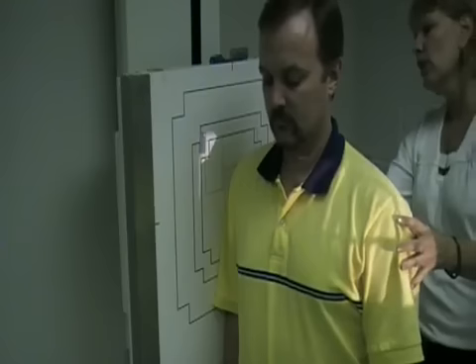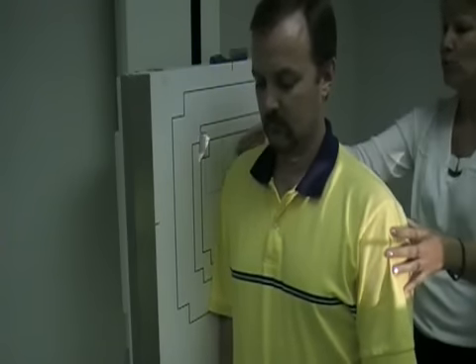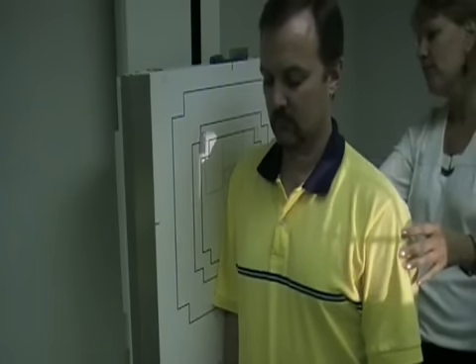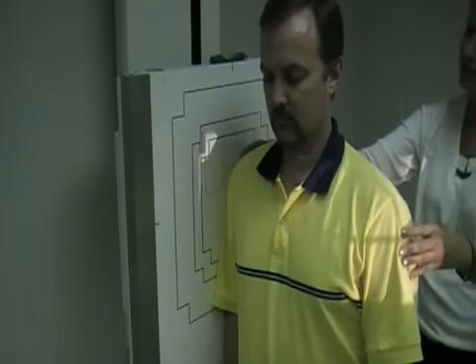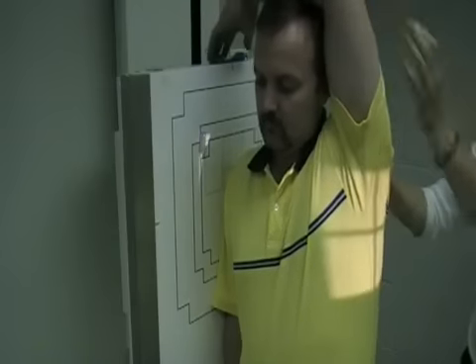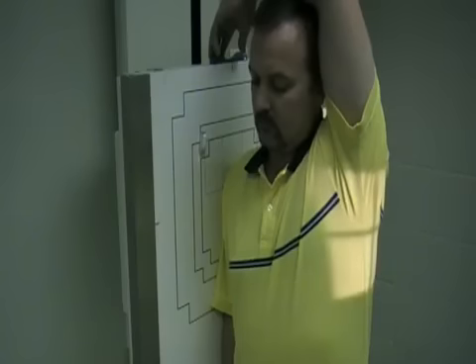And we're going to line up the body so that the surgical neck of the humerus is going to be approximately at the center point of our IR. So I have that portion of the arm right up against the board. So this is our affected arm, the right arm, and we'll have the good arm raised over the head, and we'll be shooting this projection through the patient's chest.